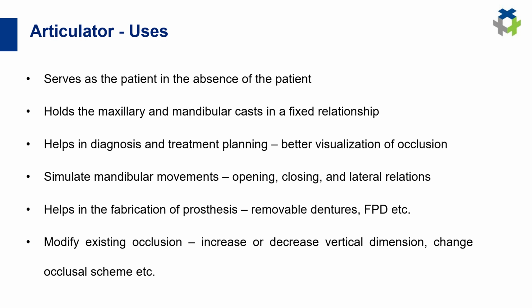It can also simulate, as I told you before, it can only simulate and not replicate the movements. Briefly, the movements are opening, closing, and right and left lateral relations. It also helps in the fabrication of various prostheses such as removable dentures, fixed dentures, etc., including the most common ones like complete dentures or even the advanced options like implants. For everything, we definitely require an articulator.